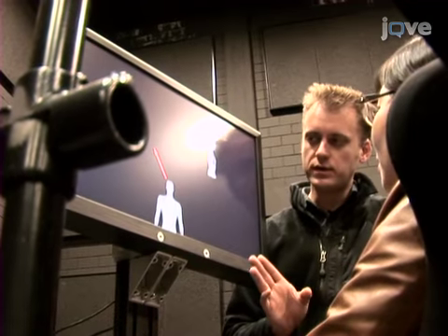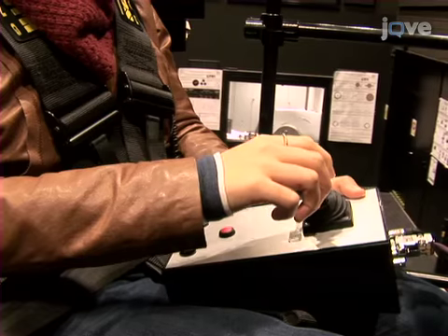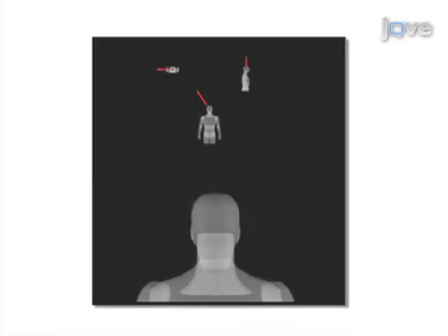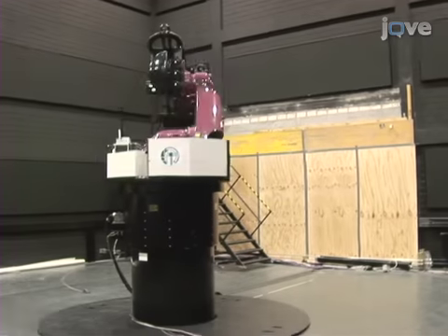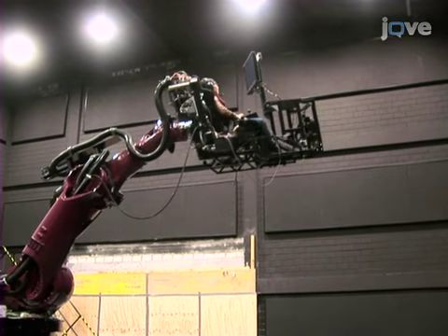Prior to the trials, it is vital to train the participant to use the feedback system accurately. They should be able to point the arrow to objects in their surroundings, such as the joystick resting on their lap. During the trial, movement of the joystick is constricted to the trajectory plane, and participants can use any or all viewpoints. When collecting data, each experimental condition is repeated 3 times and presented in random order.